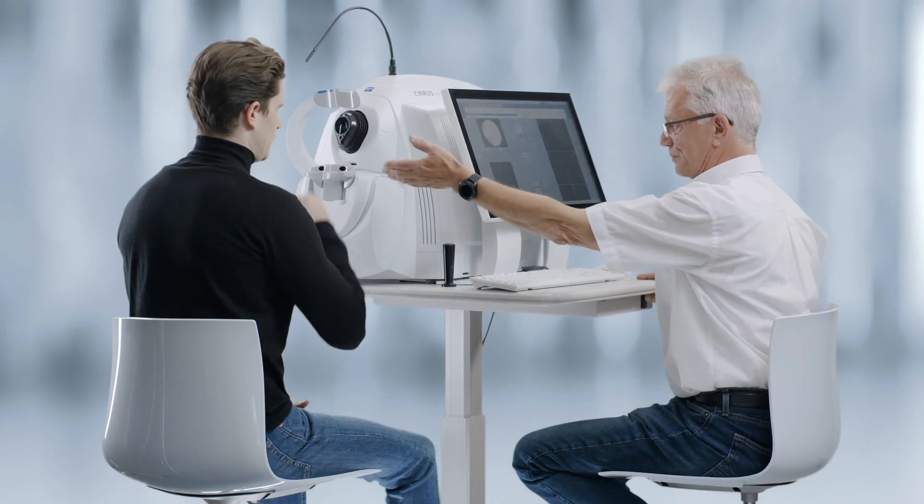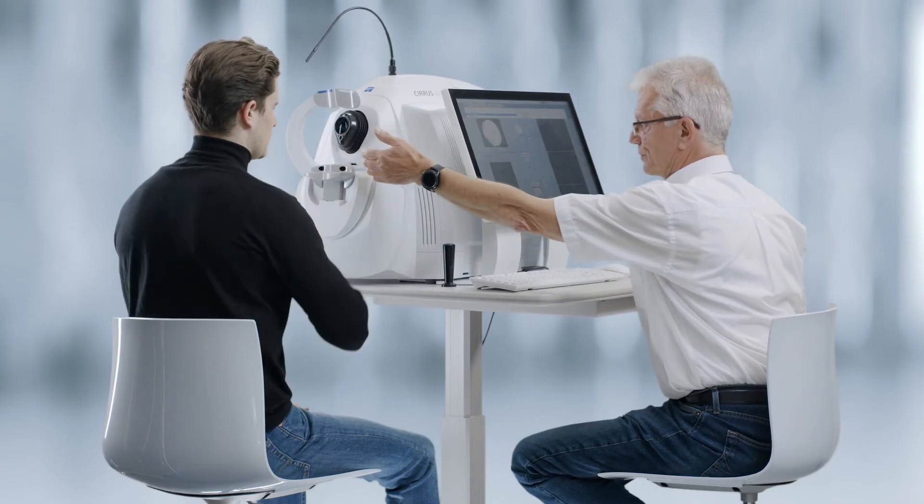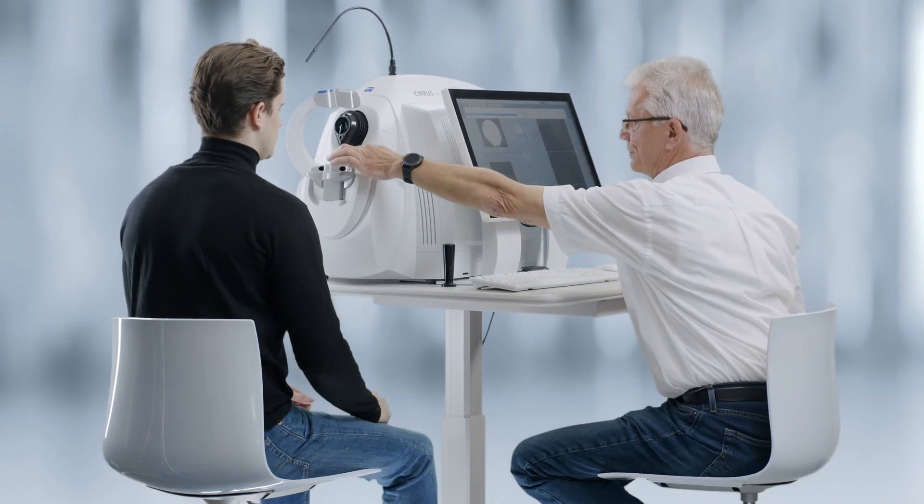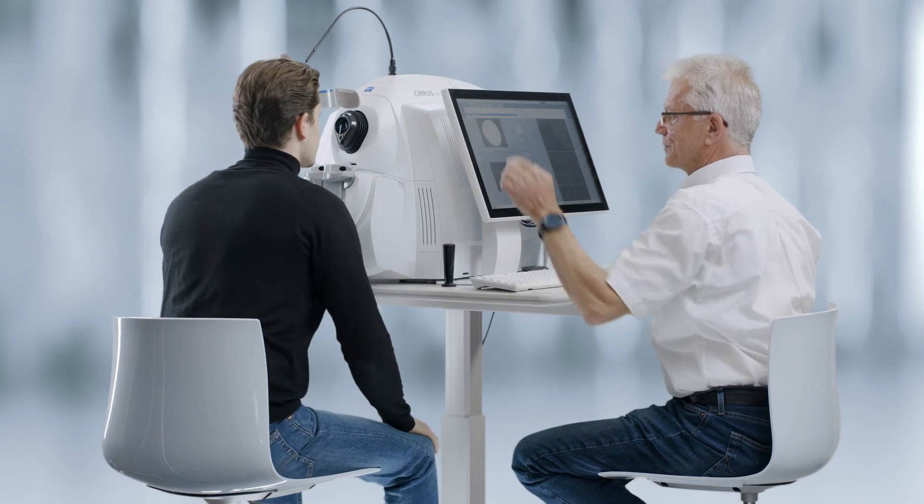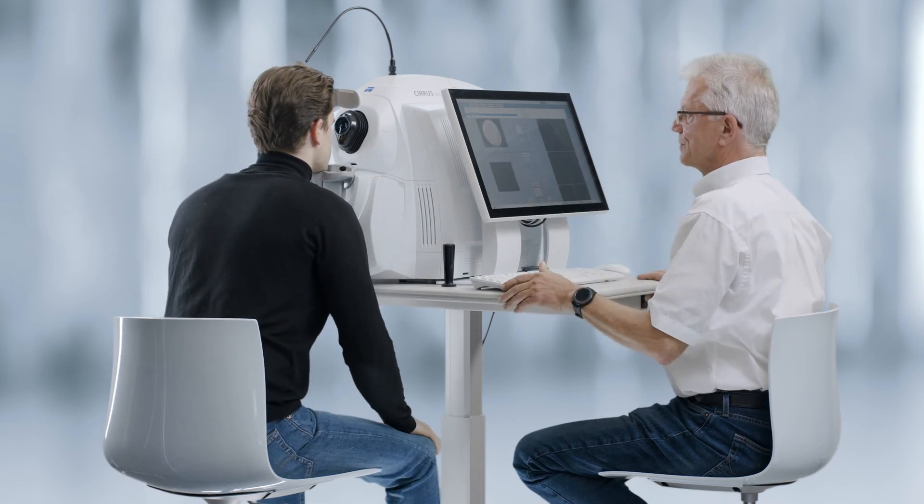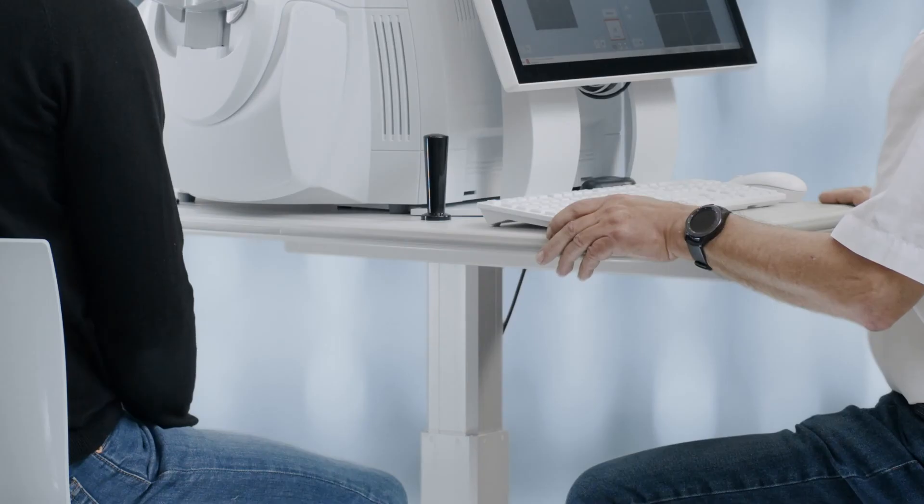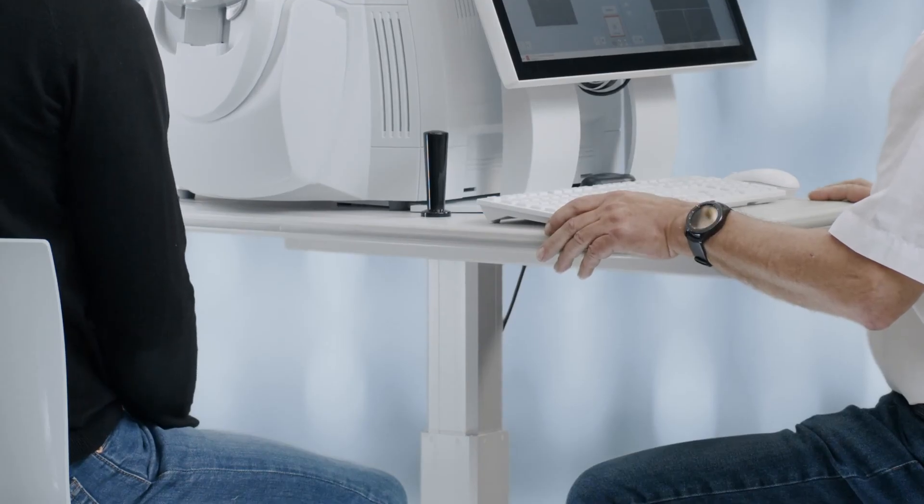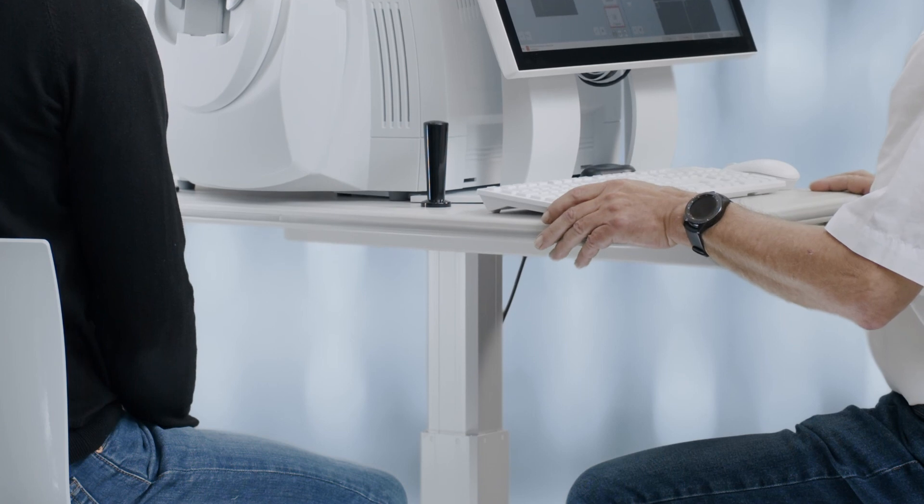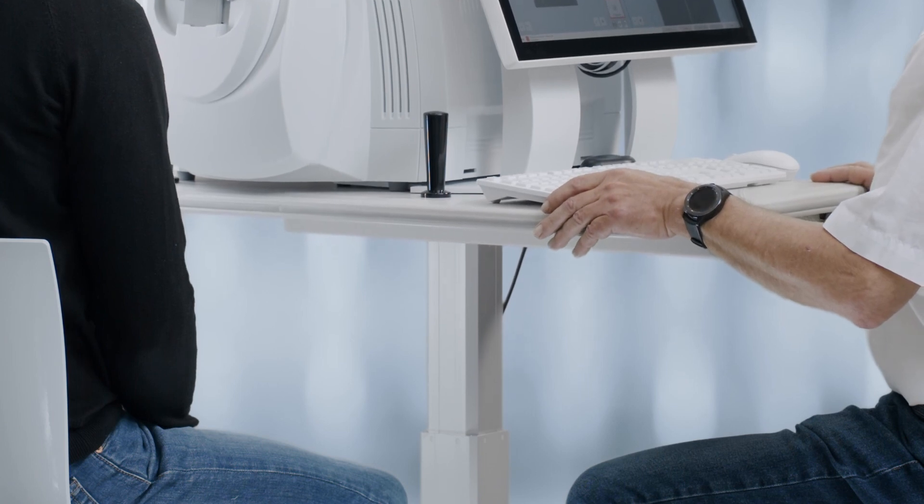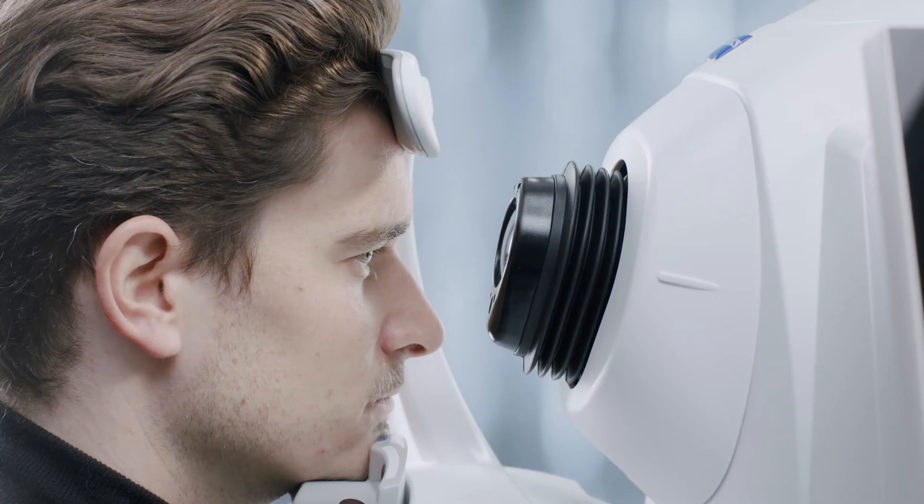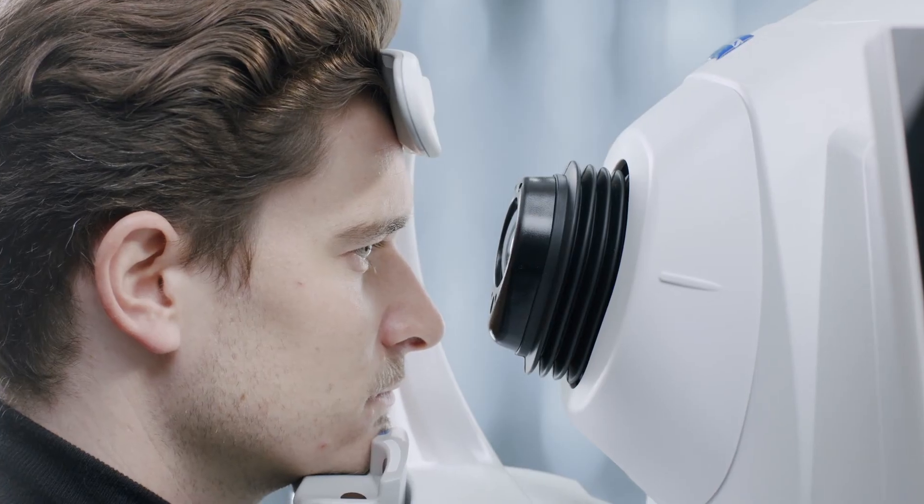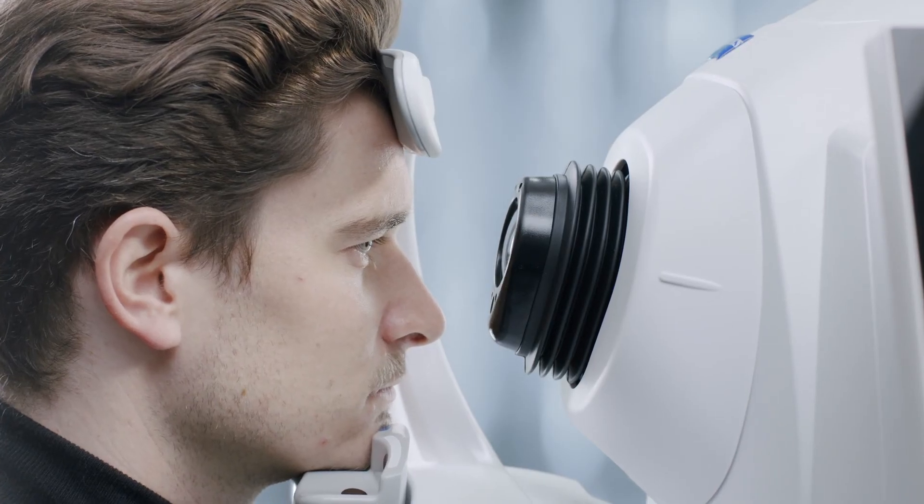Ask the patient to rest their chin on the chin rest and their forehead against the forehead rest. Adjust the table up and down for correct height. Ask the patient to sit comfortably.